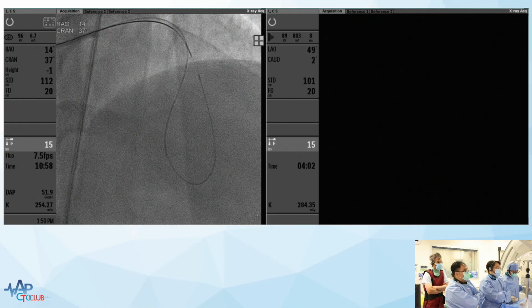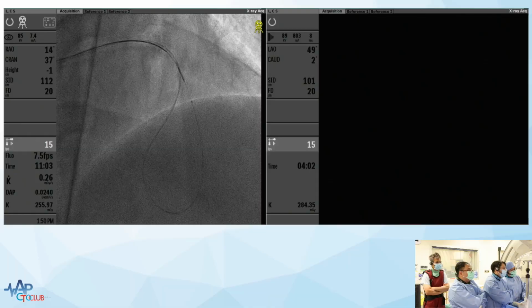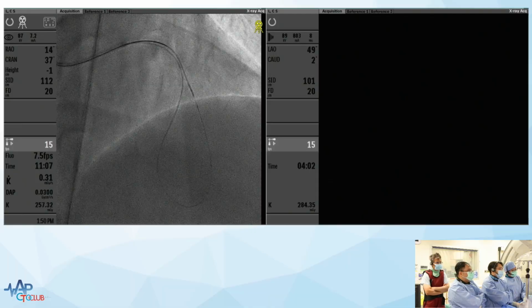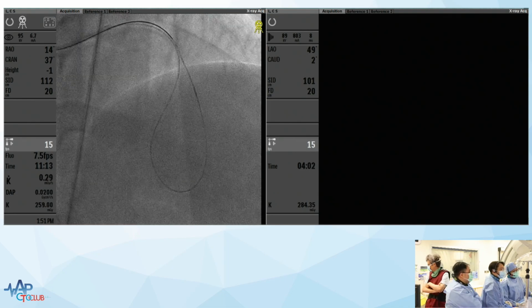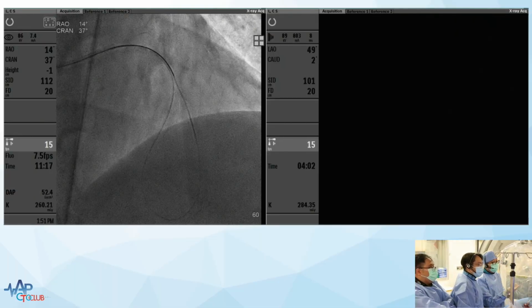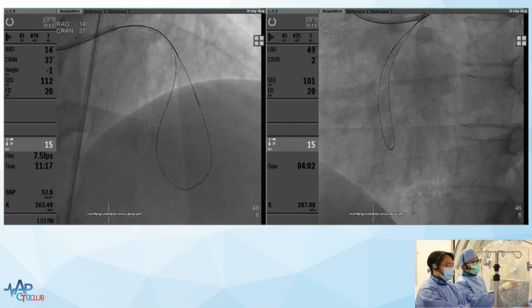This is the real life. So we want to know whether you can pass. I think it already passed the proximal cap, to be honest. But the CTO? I think it should be, because I don't have much force when I drill the UB3. You can see that it already crossed. You can see the cross-septal already crossed, fluoro save. Oh, very fast, okay. So you can see that the cross-septal already crossed the CTO body.